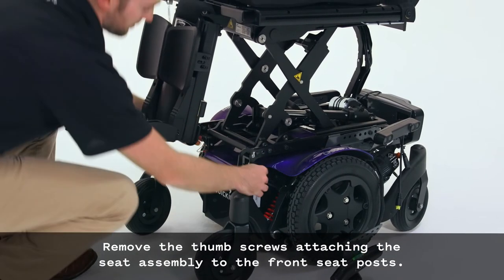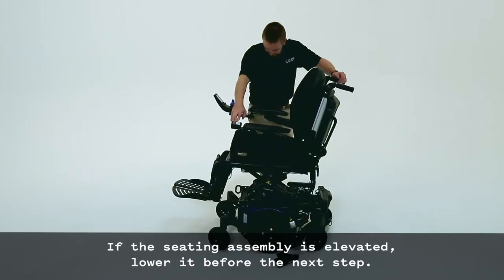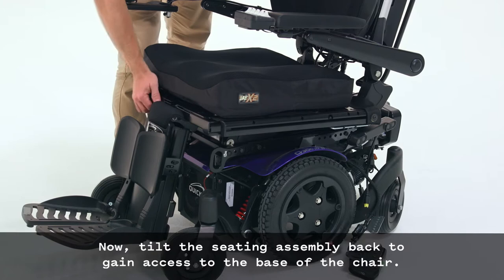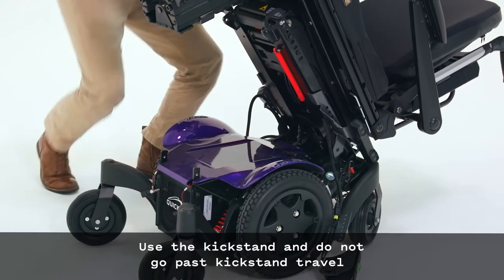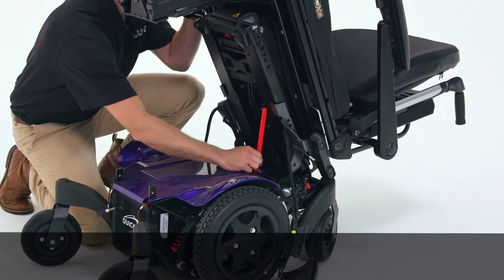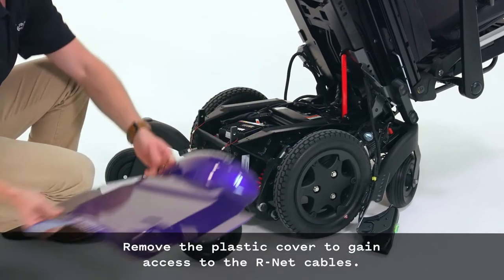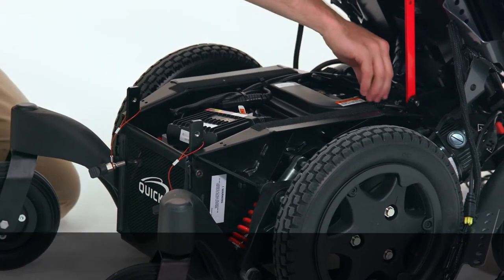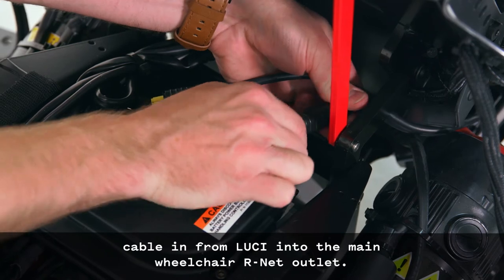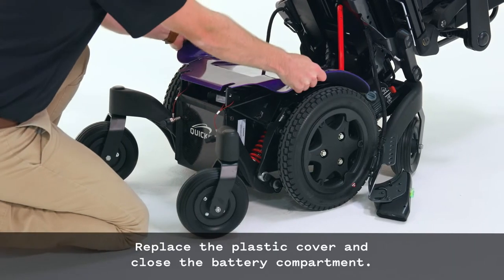Remove the thumb screws attaching the seat assembly to the front seat posts. If the seating assembly is elevated, lower it before the next step. Now tilt the seating assembly back to gain access to the base of the chair. Caution: use the kickstand and do not go past kickstand travel to avoid damaging the rear smart frame. Remove the plastic cover to gain access to the R-Net cables. Unplug the main R-Net cable, then plug the male R-Net cable end from LUCI into the main wheelchair R-Net outlet. Replace the plastic cover and close the battery compartment.